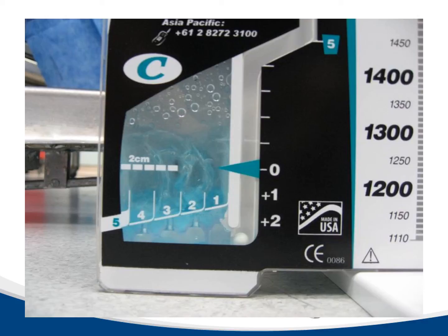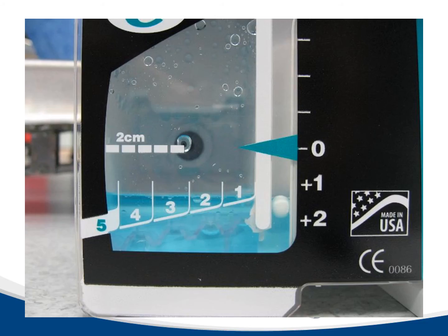Grade 1, 2 are very common and usually resolve in short time. Grade 4 or 5 indicate a large air leak, or that the chest is still open, or a problem in the system, like for instance a disconnected chest tube, or a low level of normal saline in the water-sealed chamber.